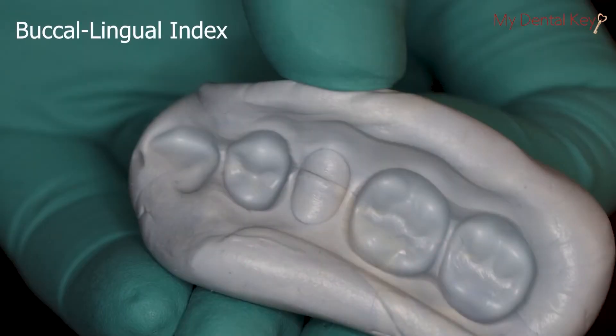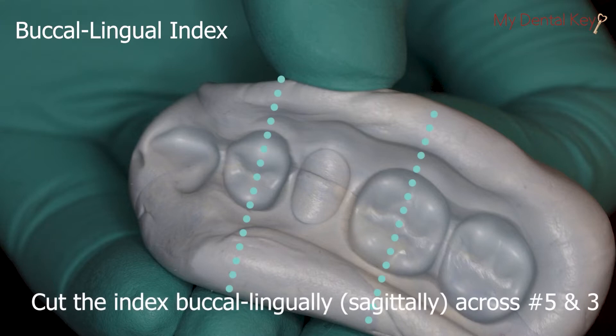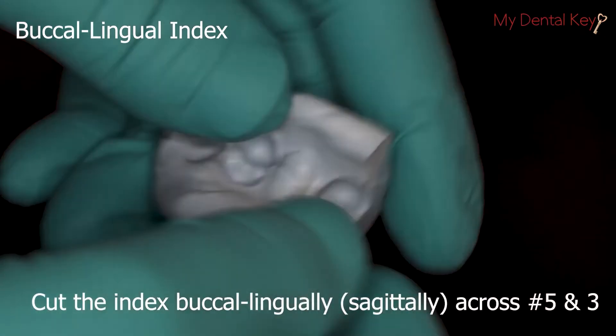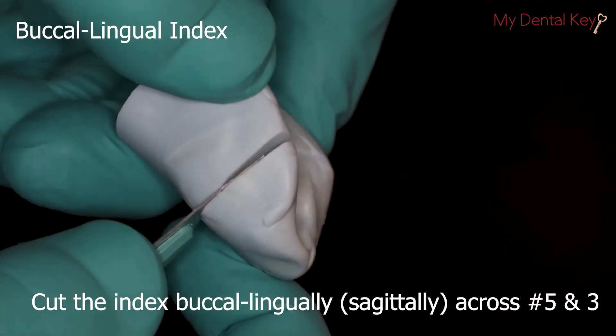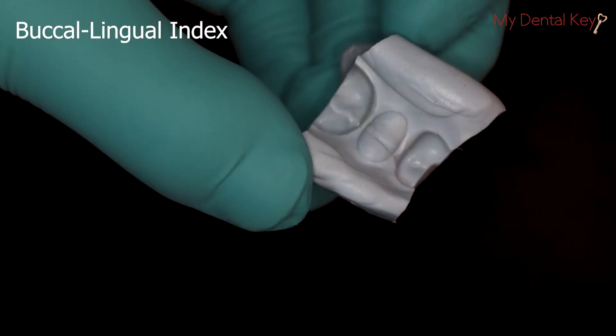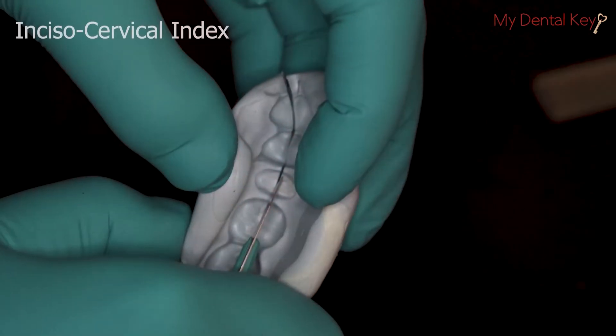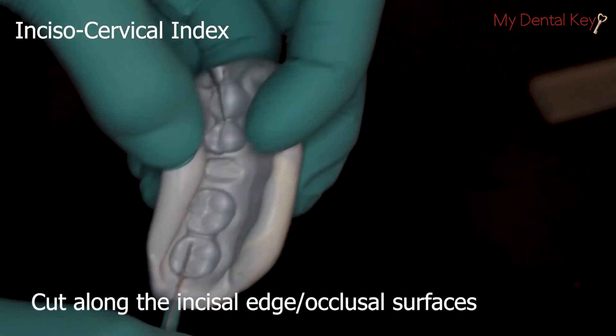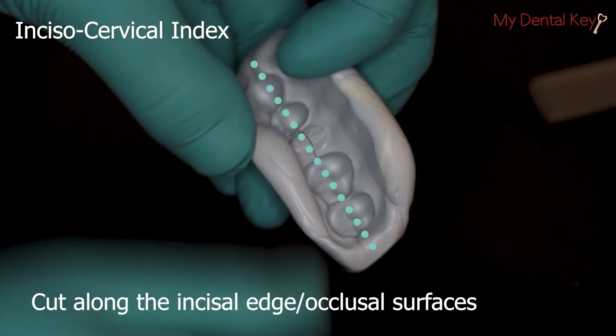For the buccal-lingual index, cut the index in half buccal-lingually, sagittally across number 5 and number 3. For the incisocervical index, cut along the occlusal surface to separate the index into a labial and a lingual half.